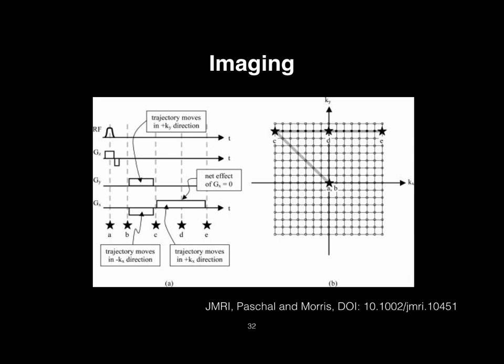So if you go super far out in kx, that means you have a very high resolution in your x direction. And if you go super far out in ky, same for that direction. Okay. So one thing to take away from this is that even though we do these things cohesively and most of our images turn out to be square, we can manipulate these things on a per-dimensional basis independently.